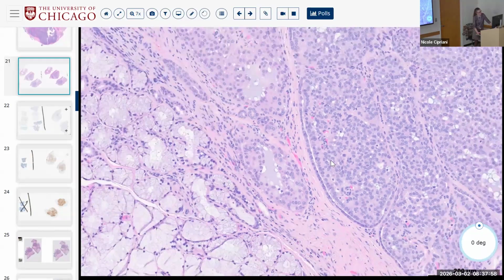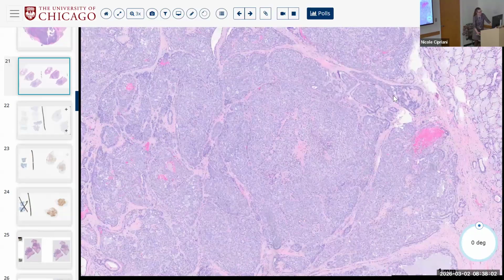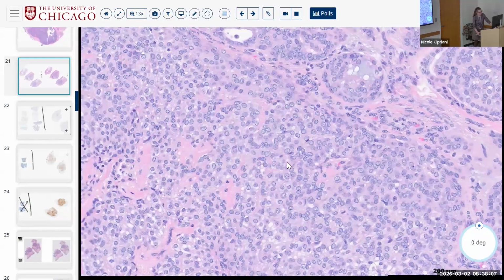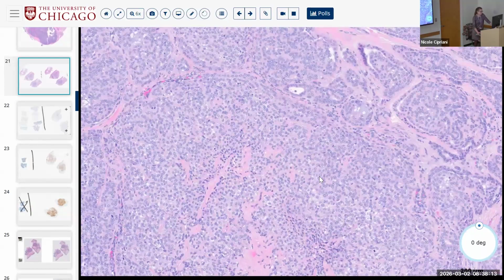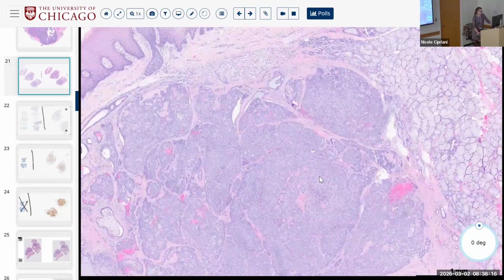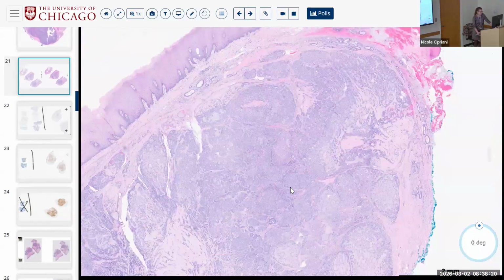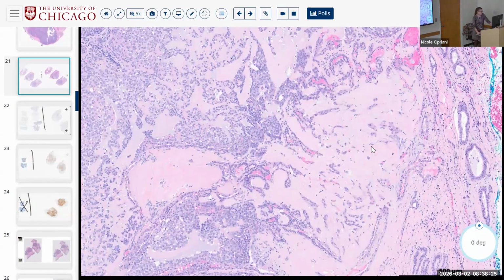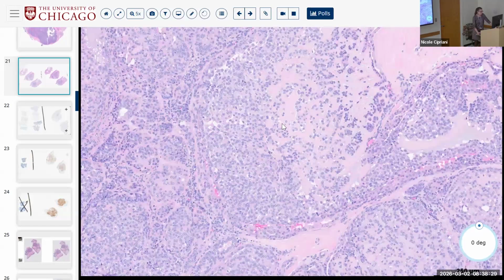Yeah. So I favor it's a monophasic tumor from what I'm seeing so far. Nuclei look pretty low grade, kind of vesicular chromatin. I'm not looking for any other features. No mitotic figures from quick scan. Yeah, I guess there's kind of hyalinized stroma here, some myxoid stuff, some single cell.